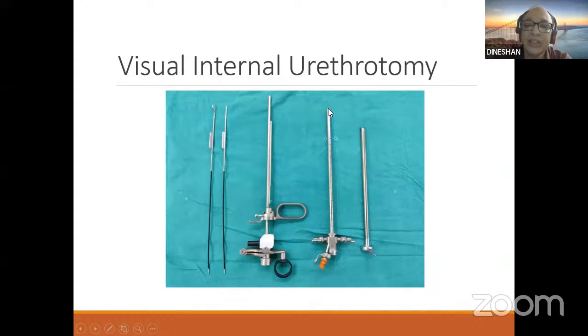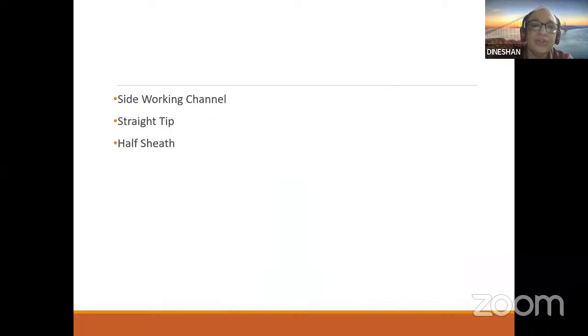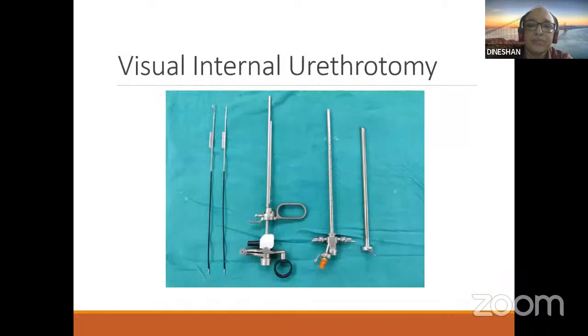Otherwise, introduction of this sheath will damage the urethra. So always introduce it with the obturator into the anterior urethra, beyond the meatus, then change it and pass the working element with the blade assembly, so that you will not injure the urethra.